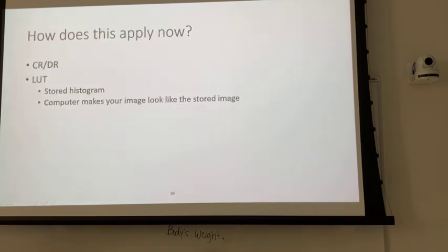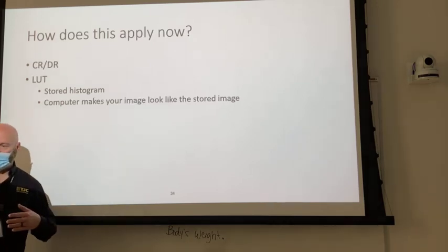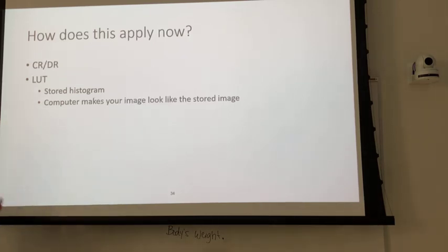So how does all this apply now? You know, it's computer magic. Your CR and DR systems, it's all about your lookup table. Your lookup table is your stored histogram, and it makes your image look like the stored image. I walked through this before, but if you get a new imaging system, the applications guy is going to sit down with a radiologist, maybe a couple of radiologists, and maybe the lead tech or super user, or whatever they call it now in the hospital.